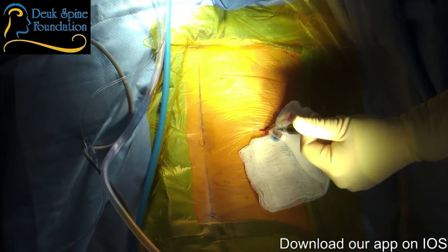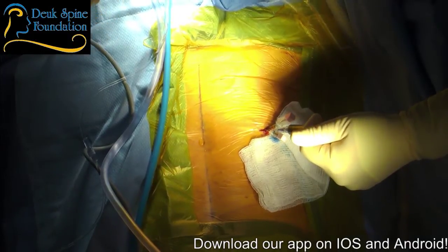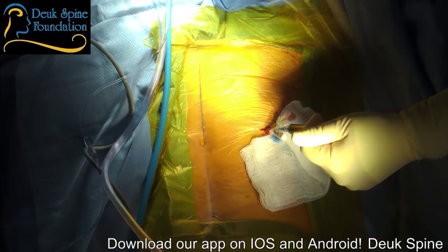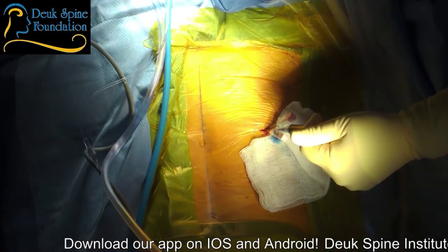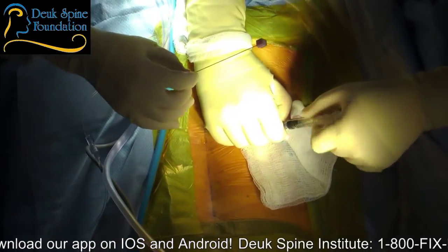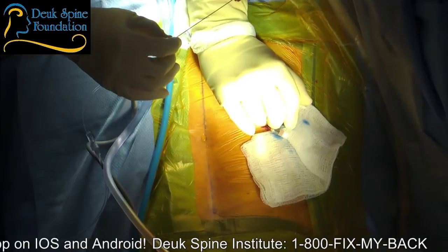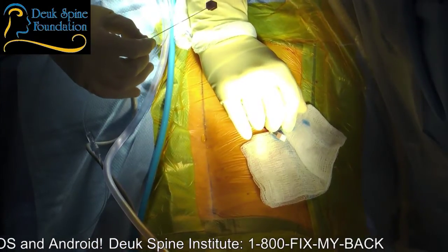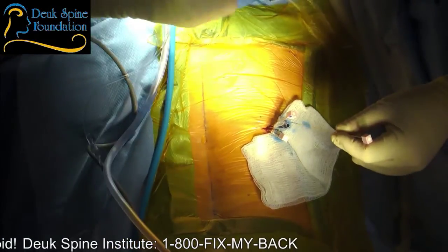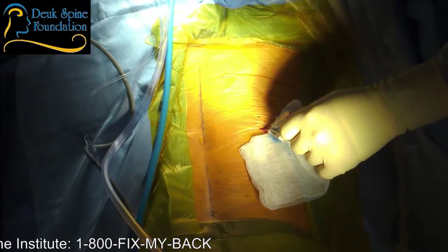Yeah, she definitely feels that. Is that your typical pain? Does that cause the pain that you normally get? How bad was that on a scale of 1 to 10? So when you have them in pre-op, make sure you talk to them. They're going to get a discogram done, and I'm going to want to know what their pain score is. I did. You did? Yes. Nice job. That's awesome. She does have a little. Yeah, I know.